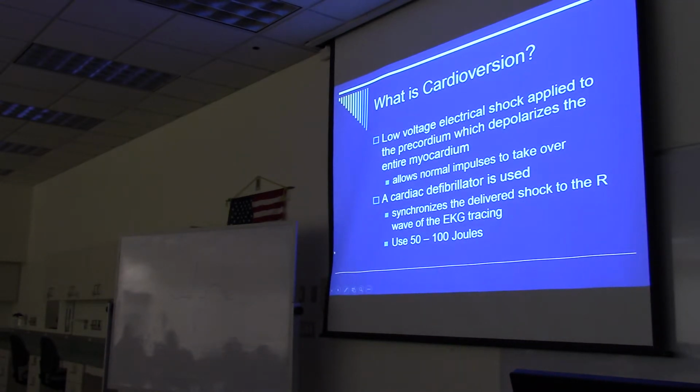The amount of energy that's being used is important to remember, so 50 to 100 joules.